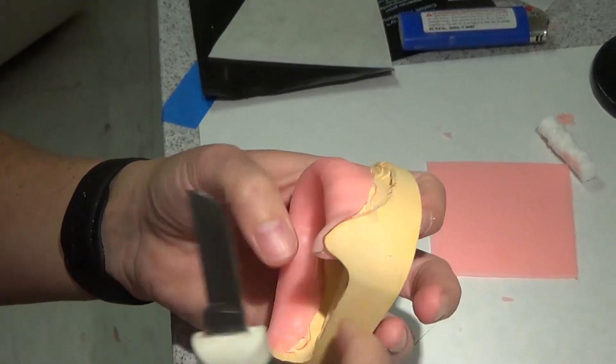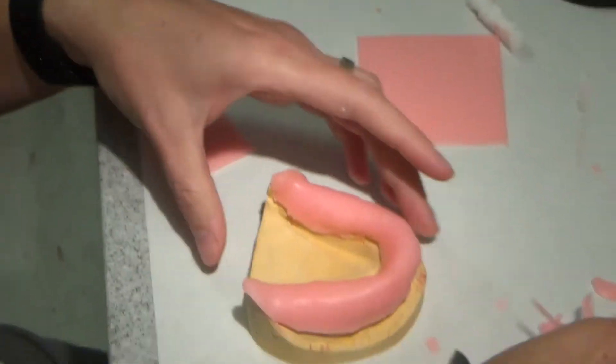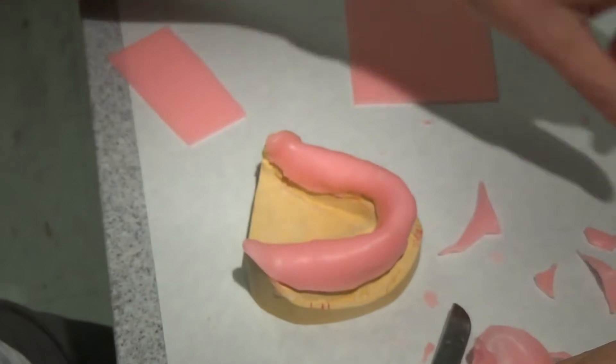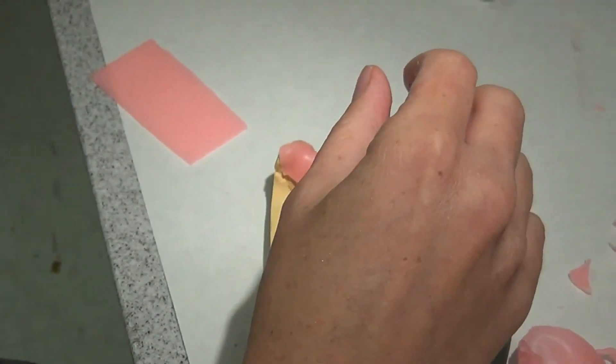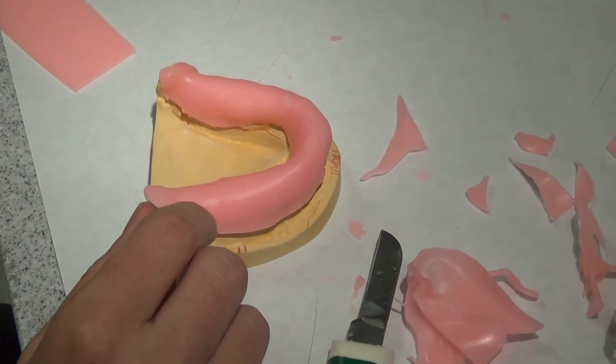Some people use sharpies so that they can really see it through the wax. I don't like to do that because I think that it makes the tray look disgusting to be honest. The black marks get in it and the patients look at the tray like, what are you about to put in my mouth?